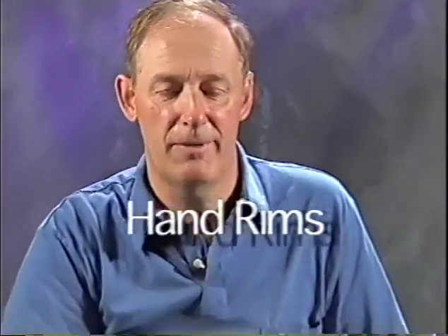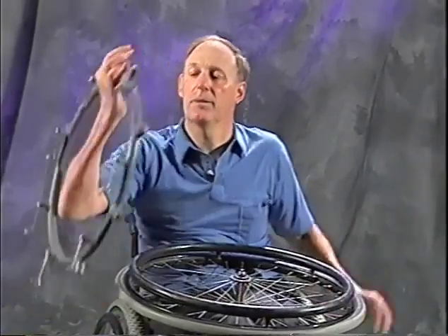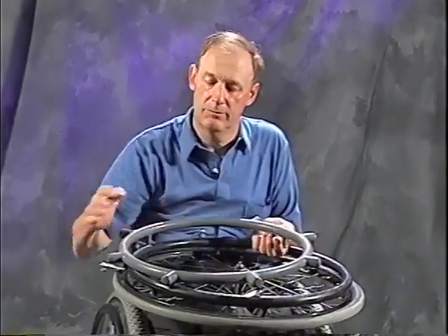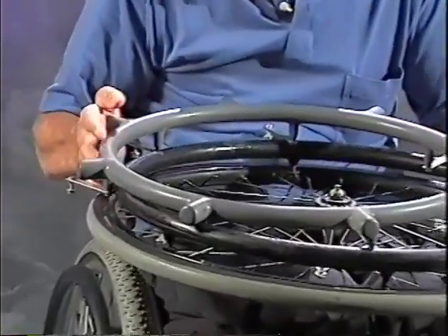When it comes time to choosing hand rims, you have 3 basic choices. There's the hand rim with projections, and these are, of course, for the quadriplegics.